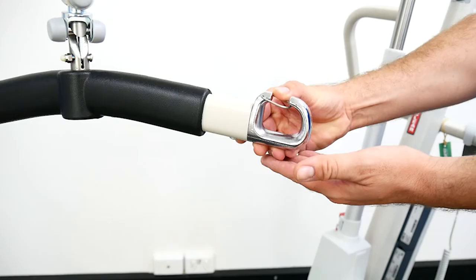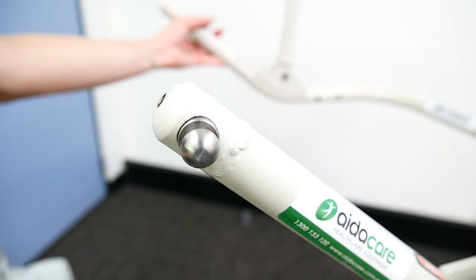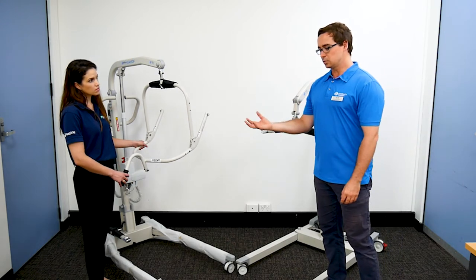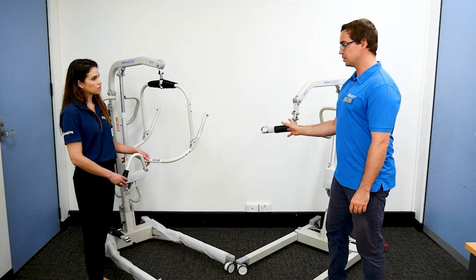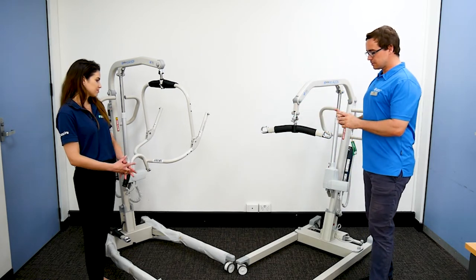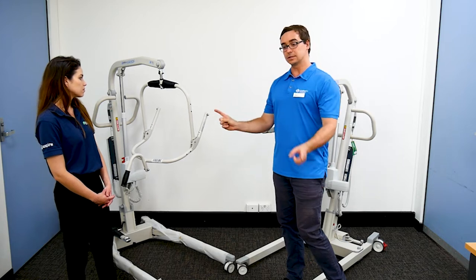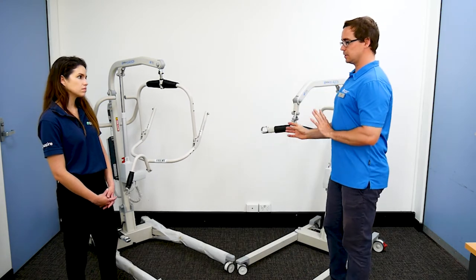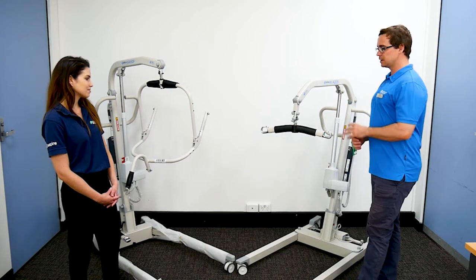Different types of slings are used with these. This spreader bar with this clip function is more of a looped type sling — you'll see this clip function here. The main thing to be aware of is that when people are using sling lifters or hoists, the sling being used is not only the right size for the person being supported but is the correct sling for the lifter. You could not use the slings interchangeably — it would not be safe. Sometimes slings could attach, particularly the clip mechanism for different models and manufacturers, but may not attach firmly and click in. So be very careful of not being complacent and using the wrong sling just to avoid the cost of a new sling — that's a really important factor.